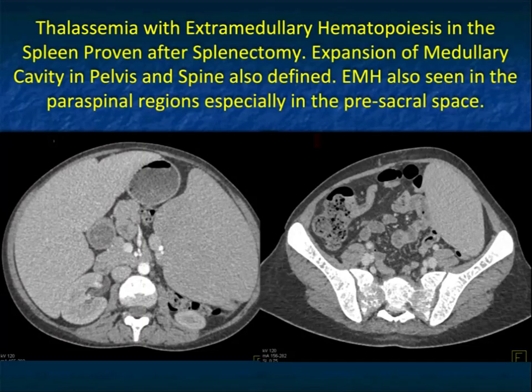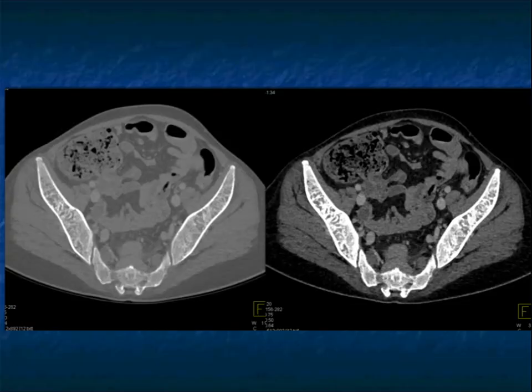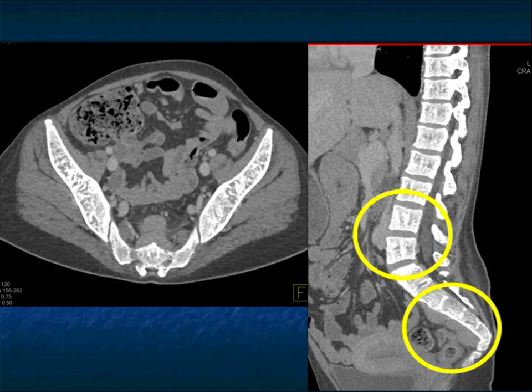Here's a patient with a really large spleen causing left upper quadrant pain — a splenectomy was performed. The pathology report confirmed: big spleen, extramedullary hematopoiesis. What you had was expansion of the medullary cavity in bone as well as in the spleen. You see bony changes in the pelvis and textural changes in the spine. The whole spleen was enlarged because of extramedullary hematopoiesis. The coarseness and expansion of the medullary components and the presacral masses — all extramedullary hematopoiesis — are very nicely shown.